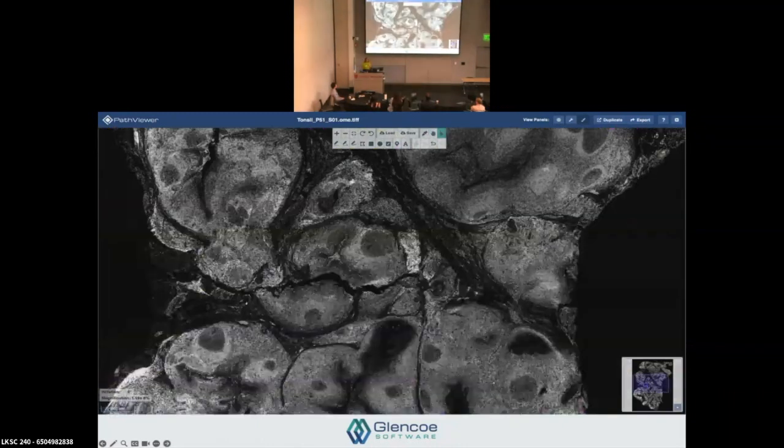And so what happens if across this very large image, you've mined through all these interesting results and you've found the objects that you care about, the class of cells that you care about, and there are 5 of them across the entire image. And how do you find them? You have to scroll through, zoom in and out, and find these teeny tiny objects that, remember, are really hard to see at this scale where you're all the way zoomed out. And so we recognize that while the tissue context is really important, when you're looking for rare populations, in a view like Path Viewer, you're trapped within the tissue context.